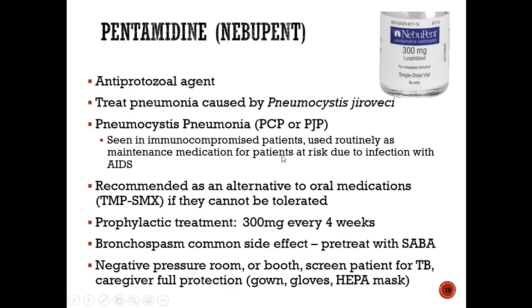And again, because this is something that is, I don't want to say low frequency because they come up, but because it's probably not something that any of you are going to be delivering, given your current ages, just keep the protocol in the back of your mind. And then the other big thing is that you always have to have the patient in a negative pressure room.